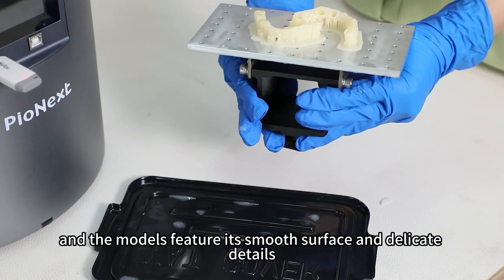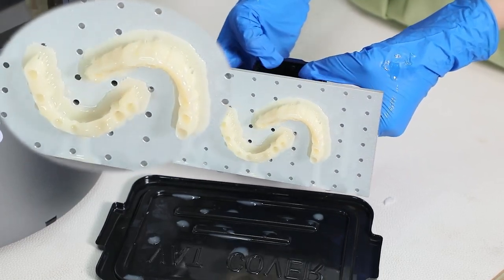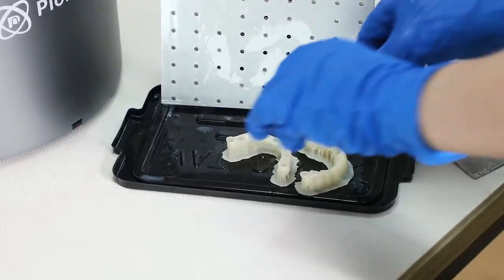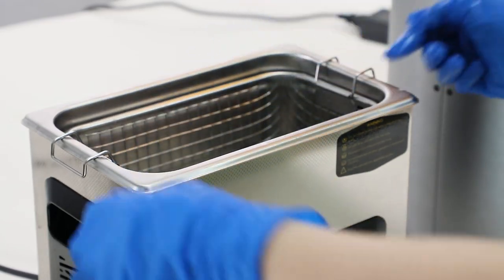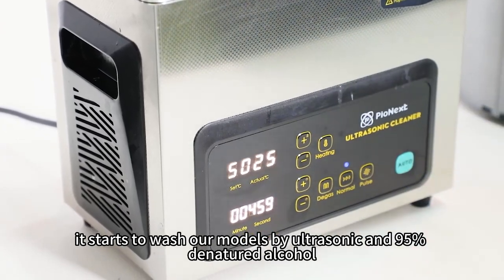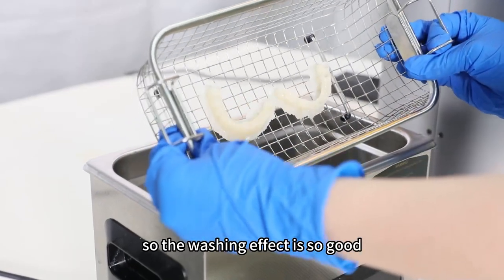We can see the printing movement is so fast and stable. The model features a smooth surface and delicate details. And then we need to put it into a washing machine. It starts to wash our models by ultrasonic and 95% denatured alcohol, so the washing effect is so good.